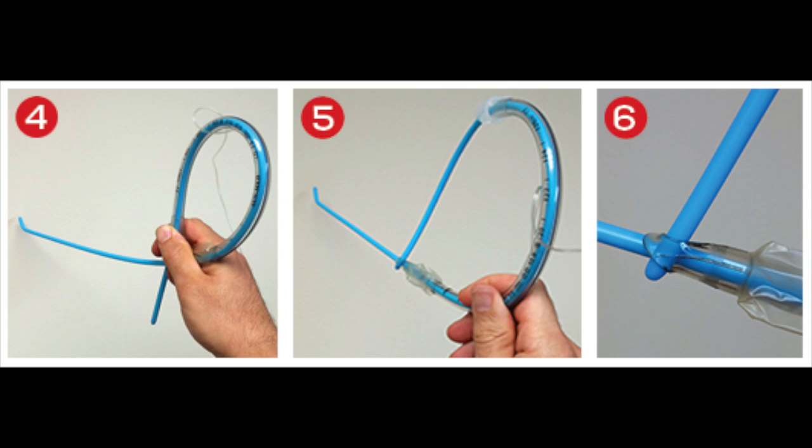Let me pull this slide down. And real quickly, let's talk about confirmation devices. For my BLS providers in the room, that tube is not in the right place until proven that it's in the right place. So end-tidal CO2 and colorimetric devices are the only ways that we're going to be able to tell. So if your ALS provider looks at you and says, yeah, my tube's good. It's in the right spot. I've got good lung sounds and no belly sounds and I saw it go through the cords. I got mist in the tube. It's not enough. You need to have full confirmations.